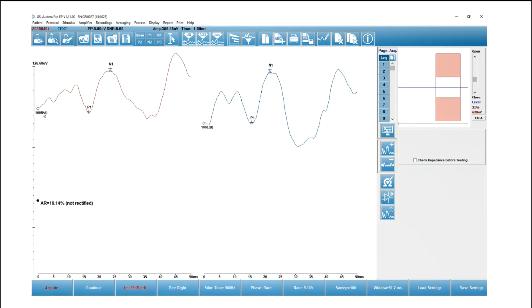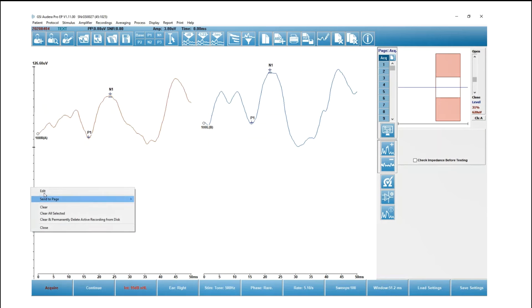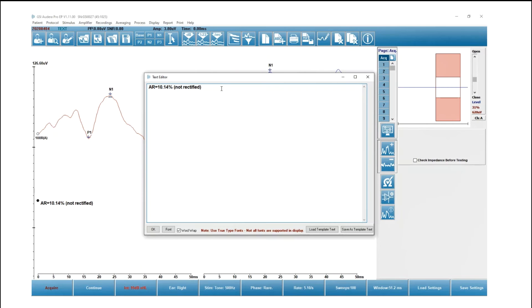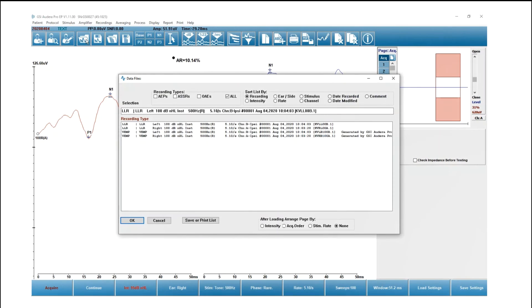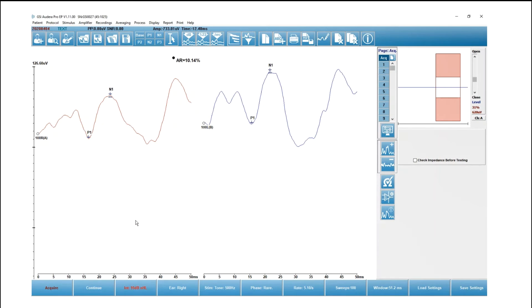From here I can proceed to organize the waveforms on the page, maybe edit, maybe remove the not-rectified asymmetry ratio, write a report, etc. By saving that report, it also saved the two VEMP waveforms, so those marked waveforms are now part of the patient's EP record moving forward. You really only need to use the VEMP analysis module when you're marking the waveforms.